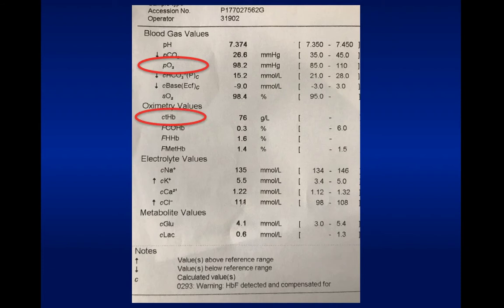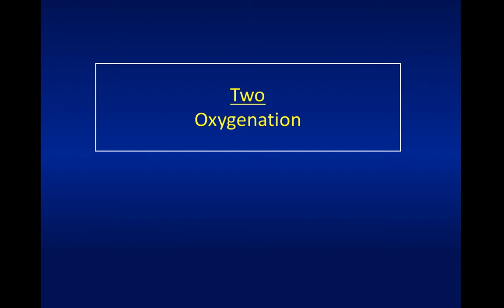Hemoglobin, if the hemoglobin comes back as 10, then that's pretty scary. And the potassium, so any potassium over 6.5, you could cause an arrhythmia. And glucose less than 3, especially if it's really low, like 2 or 1. So all of those 4 things, I just have a quick glance, make sure none of those are really wildly abnormal. Is there anything I've missed, you reckon?